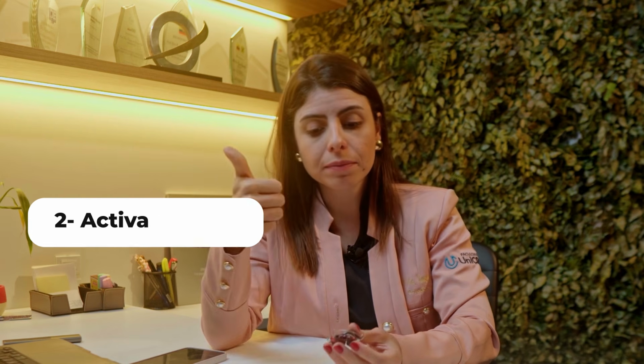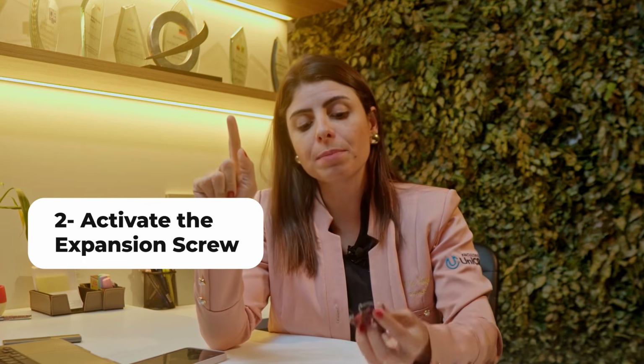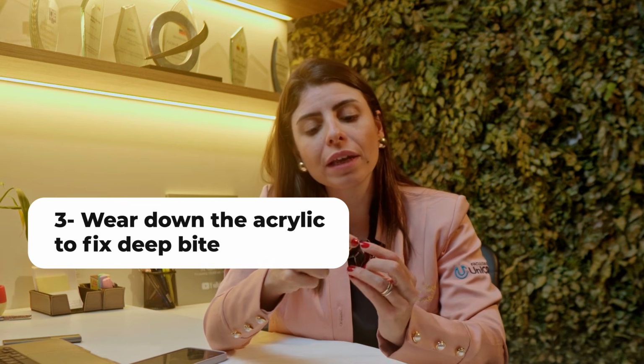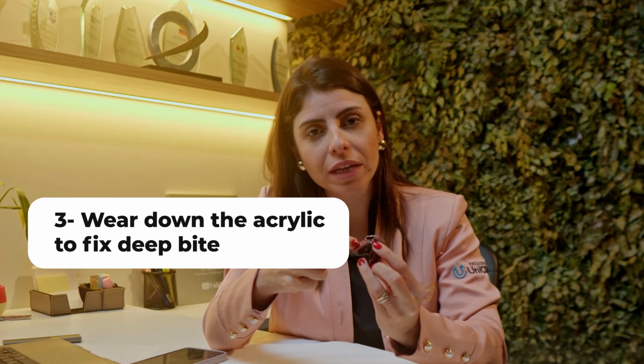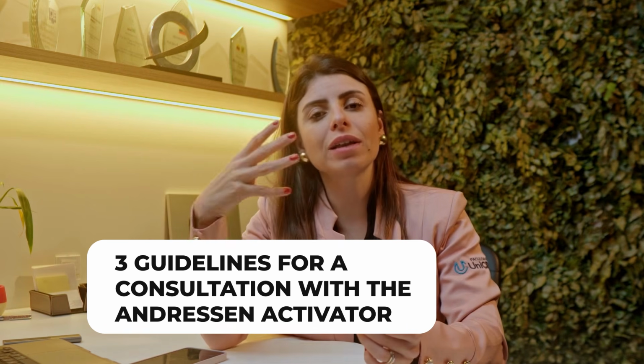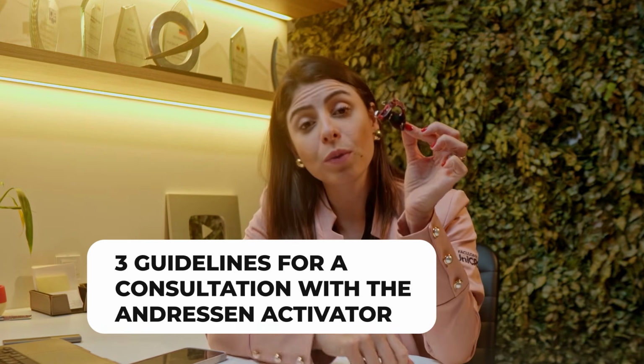I can close the little hooks of the Adams clasp, so I activate the clasps. Number 2, I activate the expansion screw to expand. Number 3, I carefully grind the acrylic material in order to solve the issue of the deep bite. So these are the 3 important activations, the 3 essential guidelines for you to follow and keep in mind during a checkup appointment with the Andresen activator appliance.